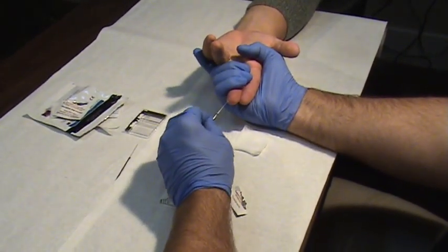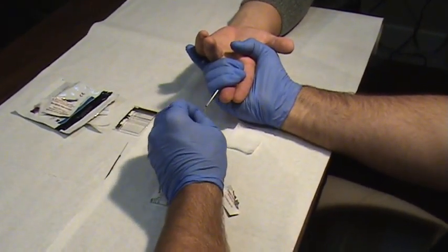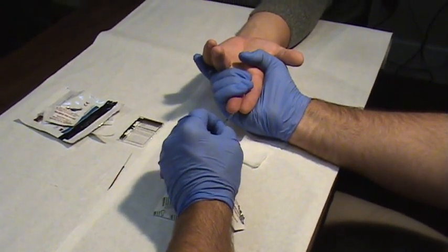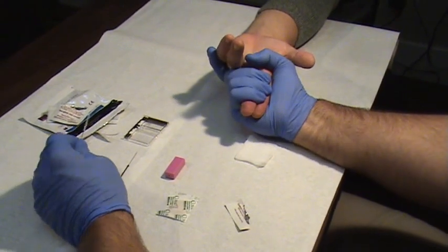On the finger, there's more nerves at the tip and the pad of the finger. And so to lessen the pain to the patient, I like going slightly to the right or to the left.